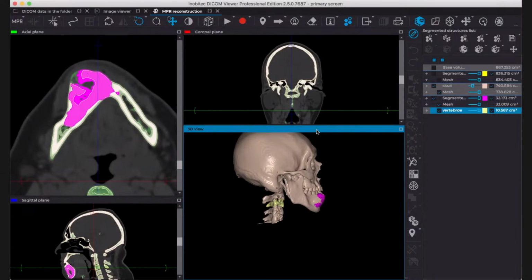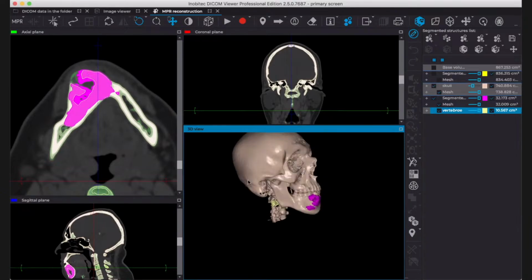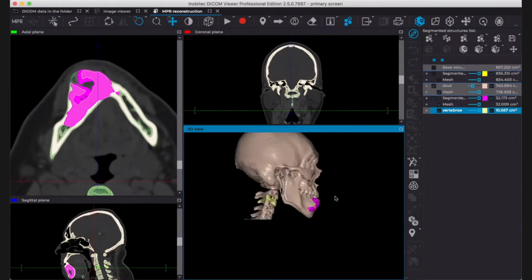Another thing that is also very nice about this software is the people behind it, which I found was the most useful thing, because they taught me how to use all the tools we normally use with any other software and how to translate it here. They're mostly the same. I found that with this software it's a little bit more intuitive and fast to create the same models. And they really listen to you. They are there to help you on your first steps.